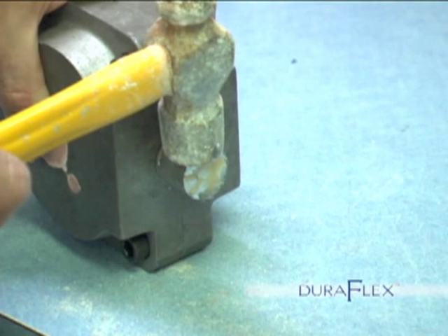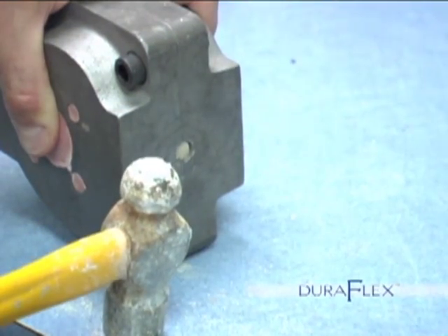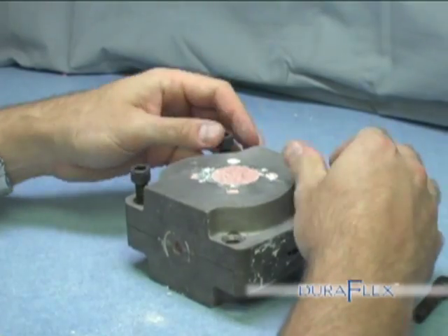De-flasking. Now that the flask is cool, it is time to deflask the appliance. First, before loosening the screws, you need to knock off the used cartridge with a hammer. Then loosen the bolts and tap the stone out of the flask.